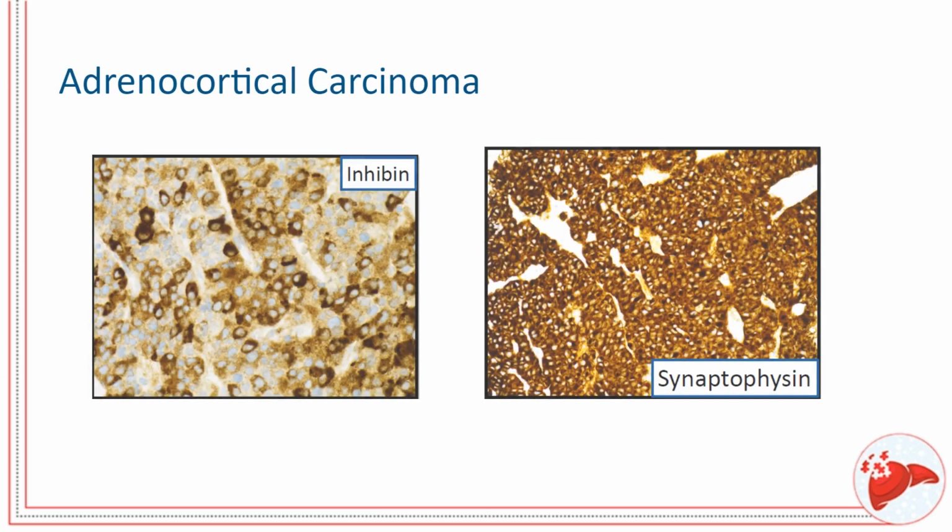An additional workup confirmed expression of inhibin and synaptophysin. This was in fact a case of adrenocortical carcinoma mimicking hepatocellular carcinoma, a really important mimic to be cognizant of. I have seen this pitfall multiple times in my practice, and a lot of it is due to not properly or carefully or thoroughly working cases up, and I think this highlights the importance of a keratin in the workup and not over-relying on Hepar alone.